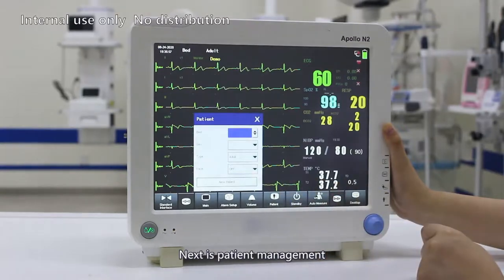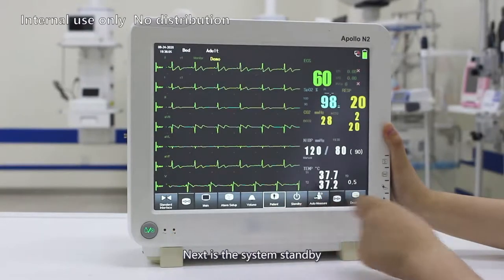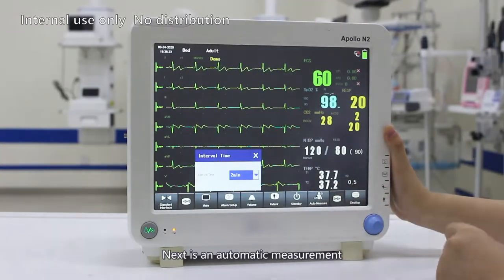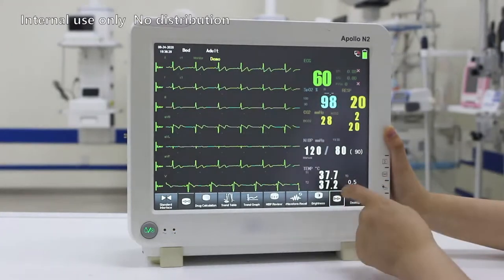Next is patient management, which is the same as the patient management function in the status bar. Next is the system standby. You can set the shutdown. Next is the automatic measurement. You can set the time interval for the automatic blood pressure measurement.